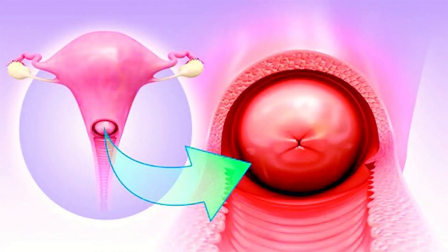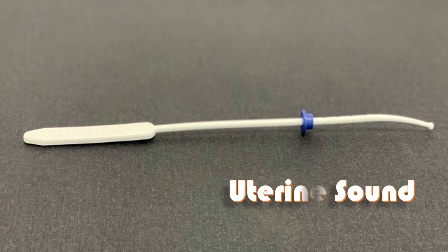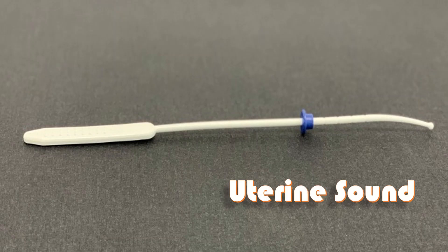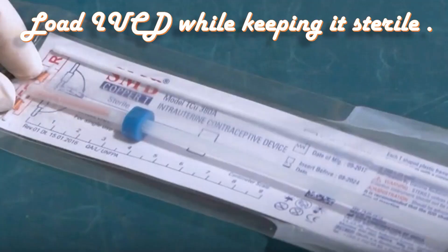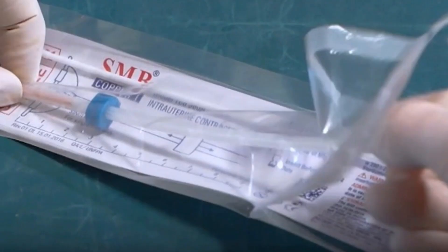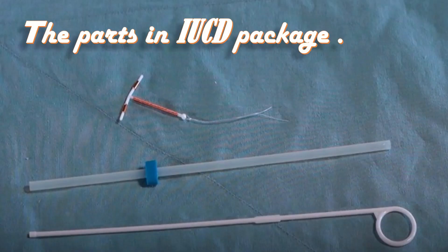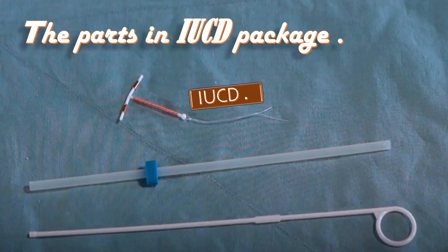I will fix the speculum to visualize the cervix and clean it with three swabs. I will hold the cervix with a single-tooth tenaculum, then sound the uterine cavity to assess uterine size and position. After measuring the size of the uterus, I will load the IUCD while keeping it sterile. The ideal way of IUCD insertion is to load the IUCD while keeping it sterile in its package — never touch the IUCD directly.